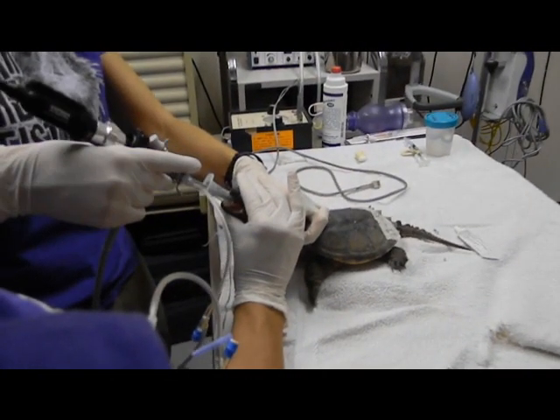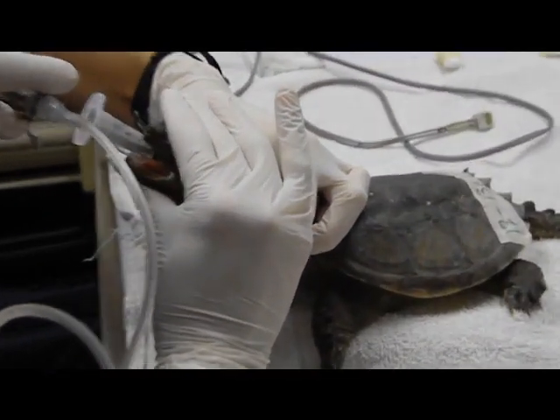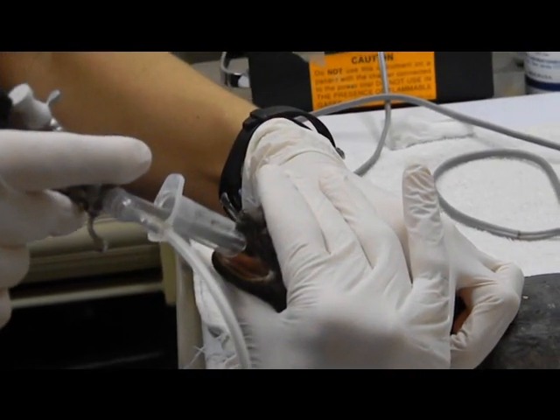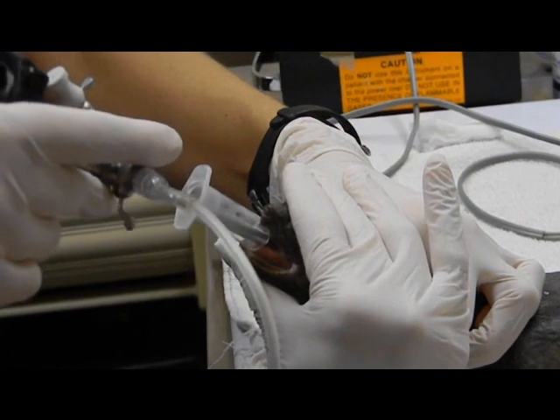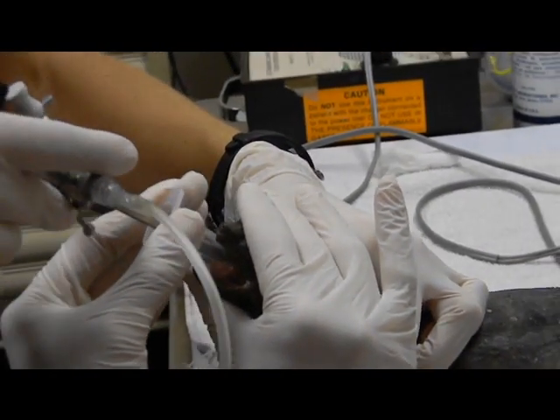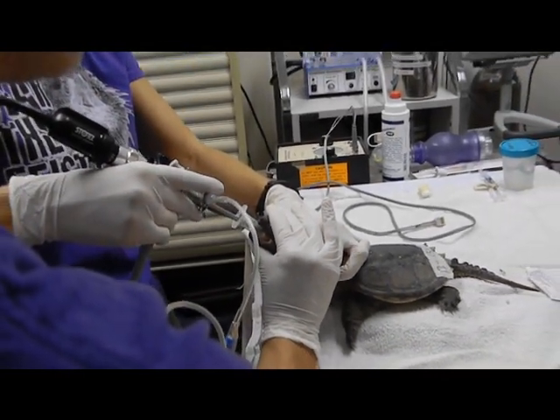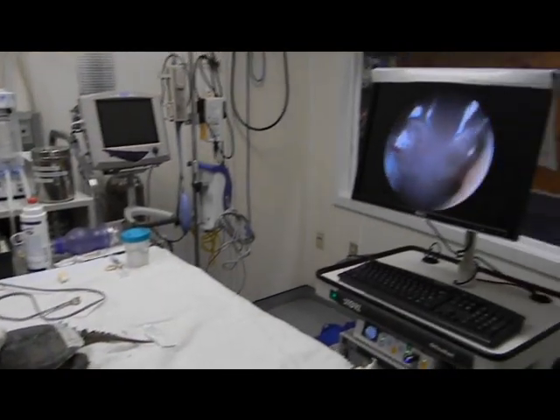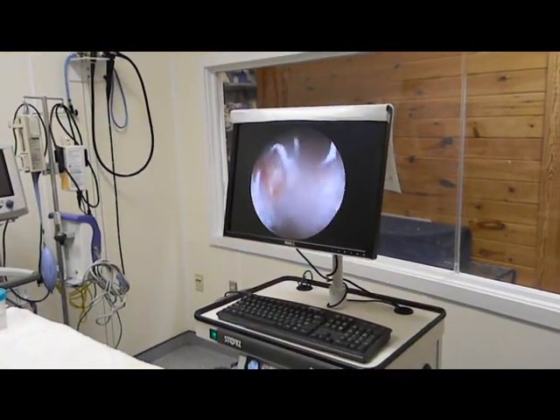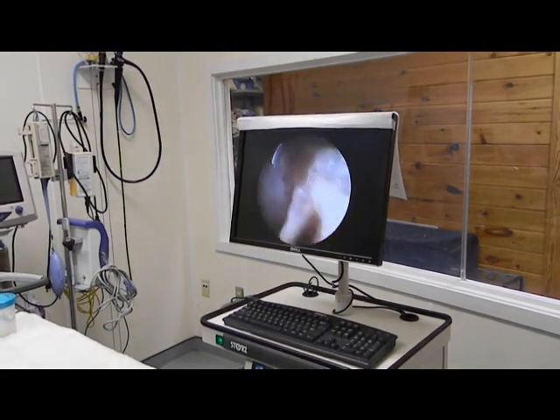We fasted him, and I'll show you the images of his first one. The spot where I ended up kind of pushing the hook through — I lacerated him a little bit, and it was about three scope lengths, which is my measurement. The scope is pretty small, so it seemed like it was a small laceration. We fasted him on Thursday, sorry — yes, Thursday. He got food on Sunday.